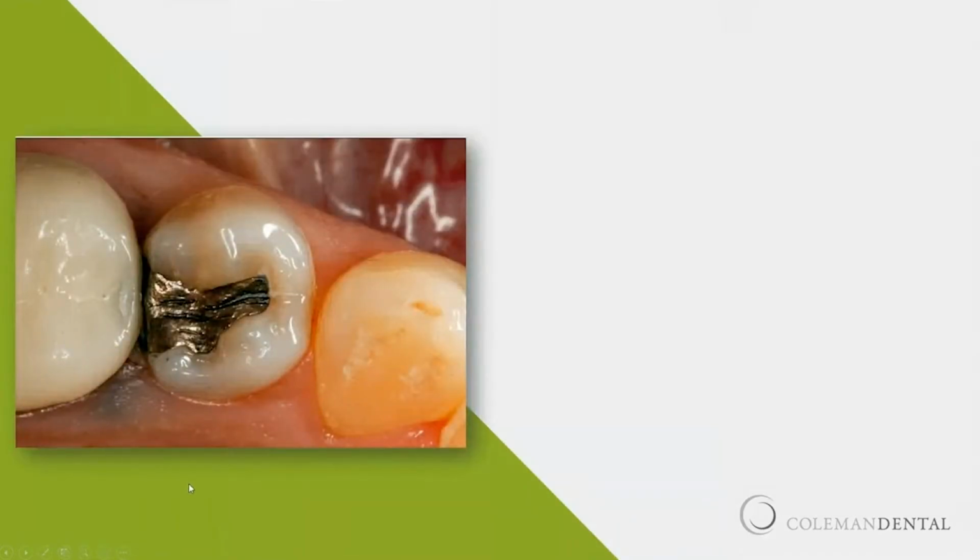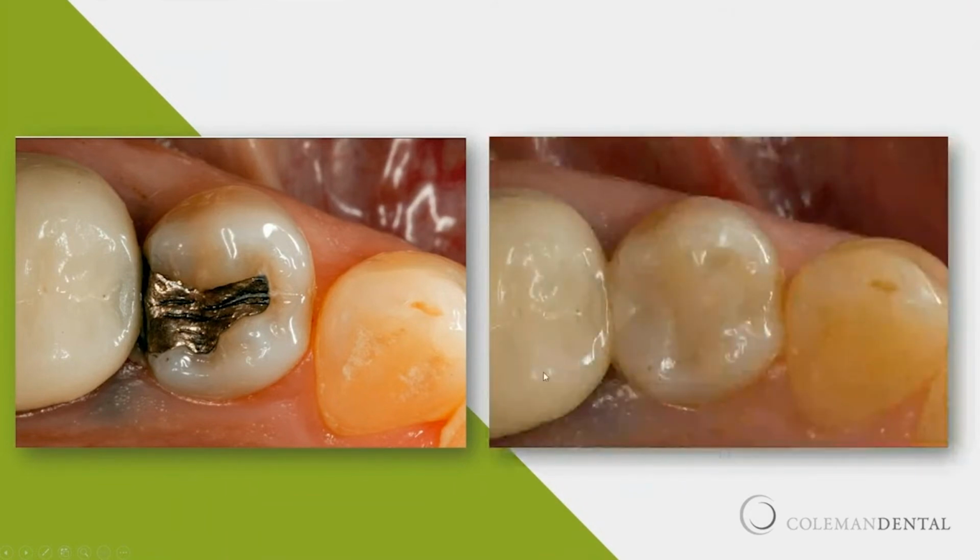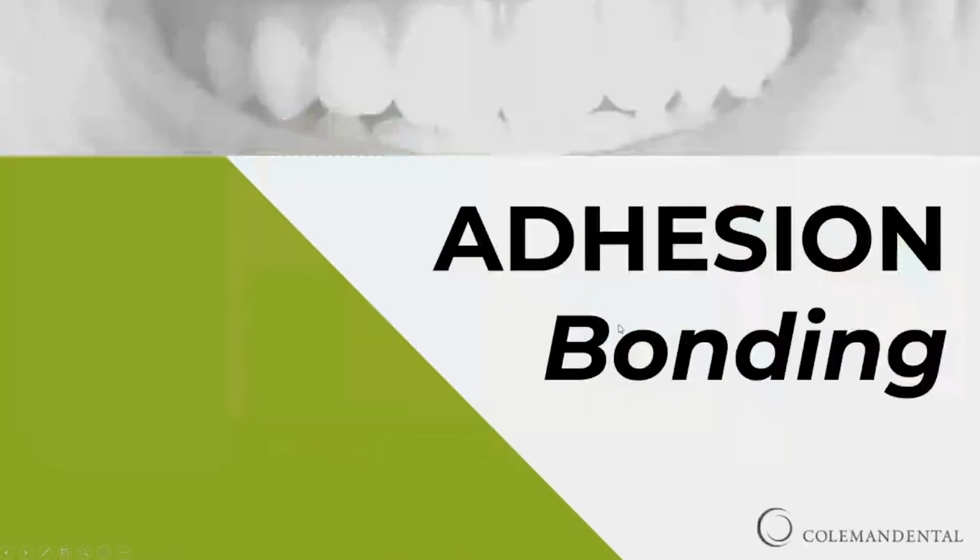So if we go through the process here real quick, if I'm going to take an amalgam out and put one in, this is number 44, almost 5 years later with Sonic Fill. The original, you can see I'm not real thrilled with the luster here. The Sonic Fill 3, which I'll show you in a second, all this has improved, but again, durable, works well. And so I'm going to work through this process with you pretty quickly.